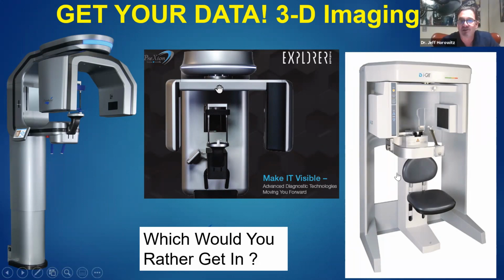So, I graduated from this old iCAT machine. I can tell you that this was a $200,000 machine, which I made my money back on in the first year, just based on the number of TMJ and airway cases that I was doing, not to mention how many patients were moving forward with implants, because I could plan them and tell them whether they were eligible candidates that very same day.